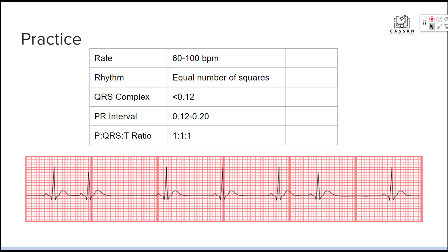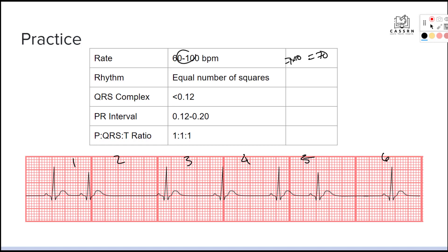The best way to get your rate in this situation is an apical pulse, but since we don't have a real patient, we're working with a six-second strip. Each mark indicates one second — six marks total. We count our heartbeats and get seven. Seven times ten equals 70, which is normal. So our rate is normal, and right now we're looking at a normal sinus rhythm.